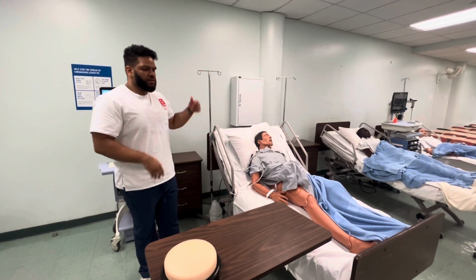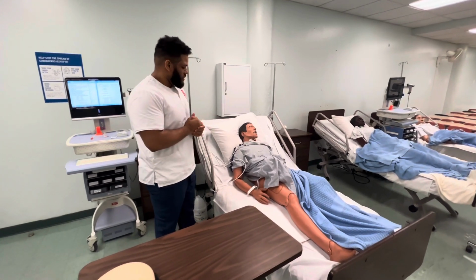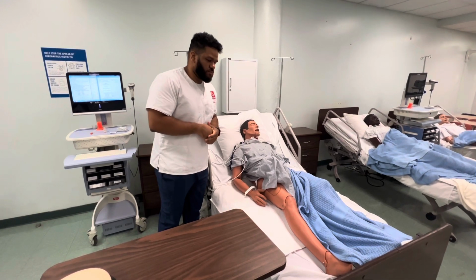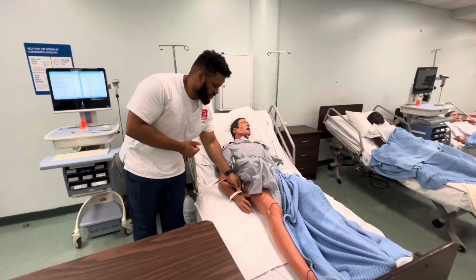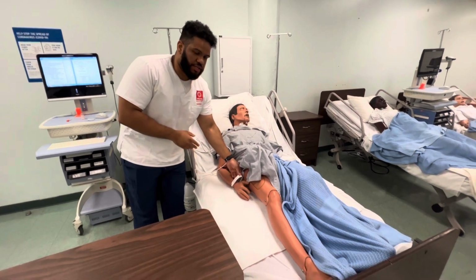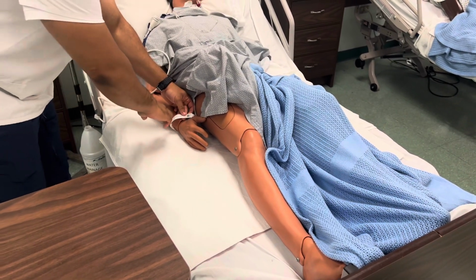Okay, so now we're ready to walk into the patient's room. All right, I'm gonna walk in, knock my presence, right? And I'm gonna say, hi, my name is Manny. Can you please tell me your name? Oh, my name is Justin Newlywed. Right, okay, my name is Justin Newlywed, and from there, I'm using the patient as a source, and I'm also gonna use the ID band. I'm gonna verify what they said. Oh, my name is Justin Newlywed, perfect, Justin Newlywed.